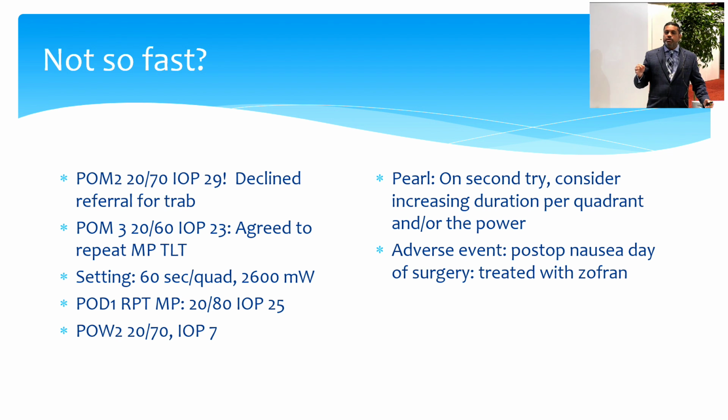I think a little bit more tricky may be to change your sweep velocity, because I'm pretty used to that ding and that small budge with the 10-second sweep per quadrant, but you could theoretically use the software to help you achieve a slower velocity and just space your budges a little bit farther apart.